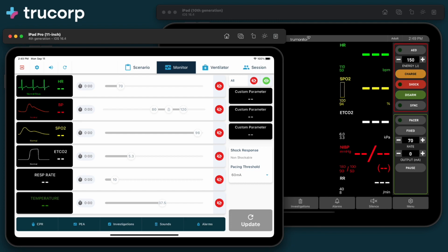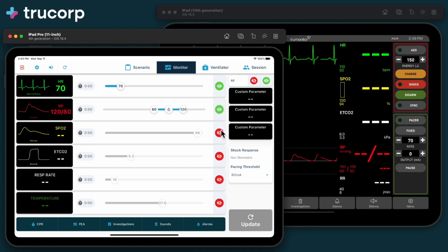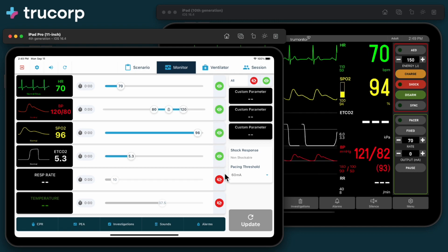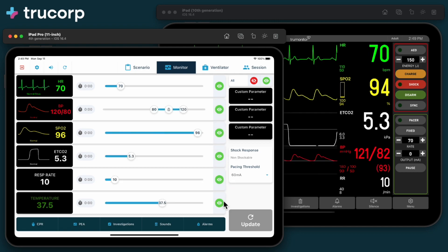Start by using the visibility buttons to activate different monitor waveforms. Visibility changes are applied instantly on the student monitor.